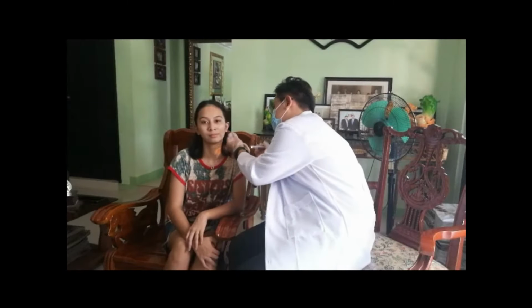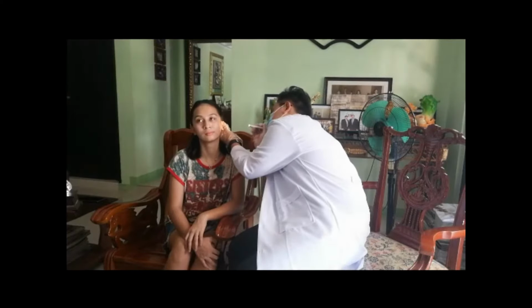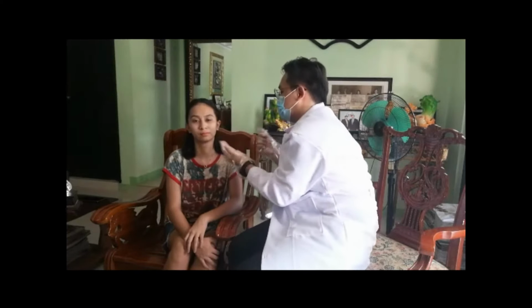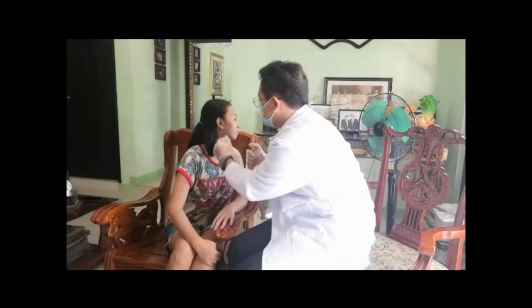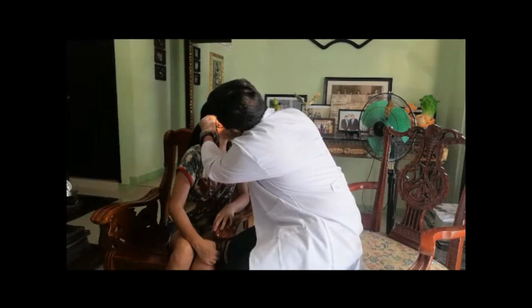Okay, thank you po. Ma'am, can you please face the other side po? Okay, thank you po. And for our next step, i-inspect natin ang tympanic membrane ng ating pasyente for color and its gloss.